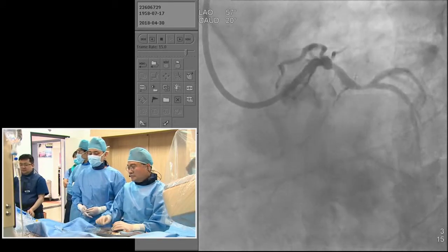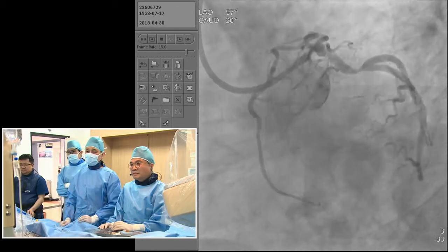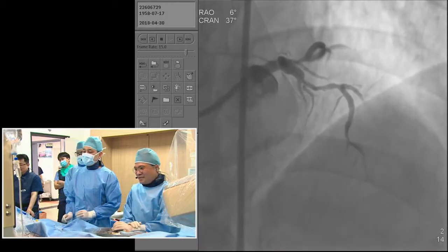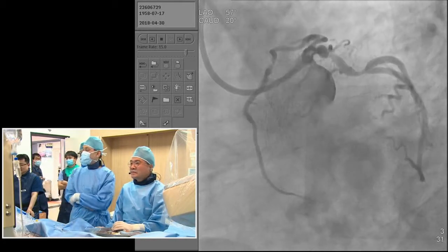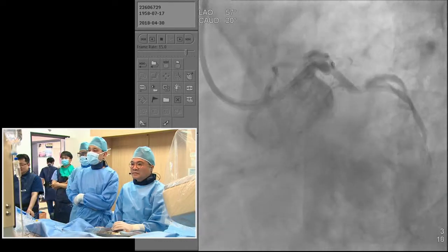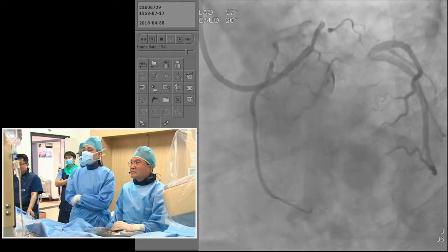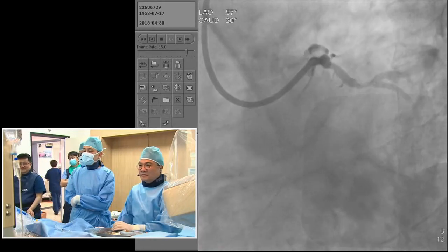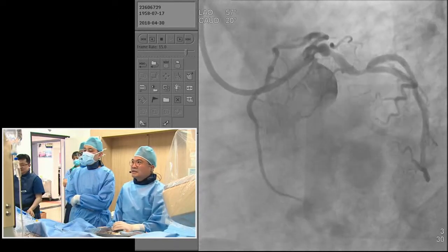Any comment on that? What about surgery from the panel? Surgery is one good option. All right, surgery. What about surgery from the audience? More than 60 attendees, 60% of attendees want a CABG. Yeah, very few. We are all interventional cardiologists. So, why don't you do that, Dr. An?